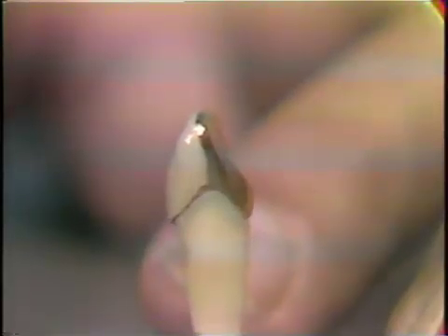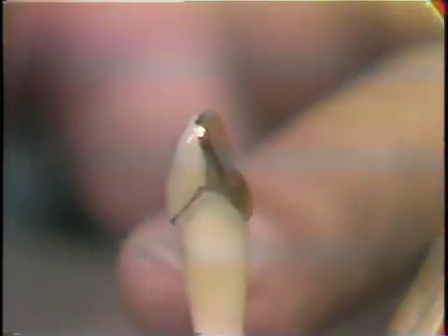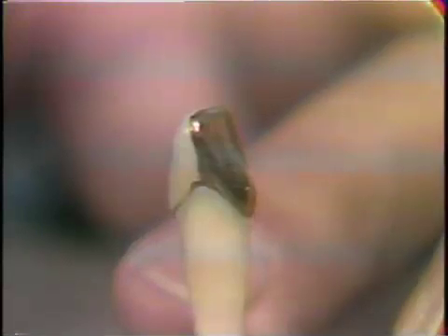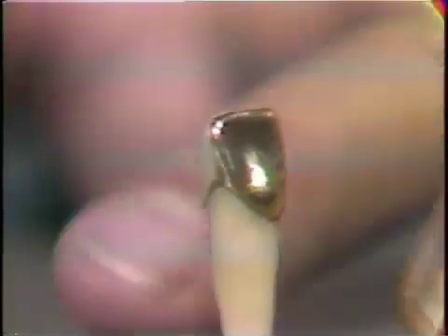As you turn around, you see the relationship of facing to the gold, and on the interproximal side, which is going to be next to either a pontic or another retainer where you have to have a connector, of course you need to position that gold so that it will receive a connector. So that in this particular situation it would need to be a little further to the labial in order to get a connector in that particular position.